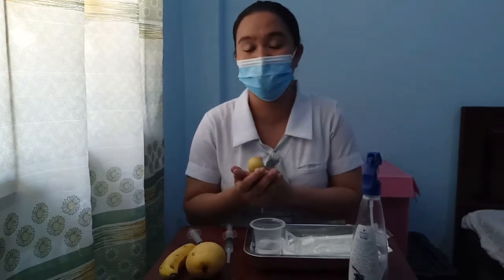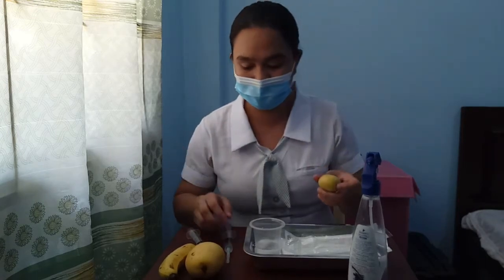Then expel any air bubbles from the syringe. The rationale for this is that injecting a small air bubble into the skin or muscle usually is harmless, but it might mean you aren't getting the full dose of medication, because the air takes up space in the syringe.